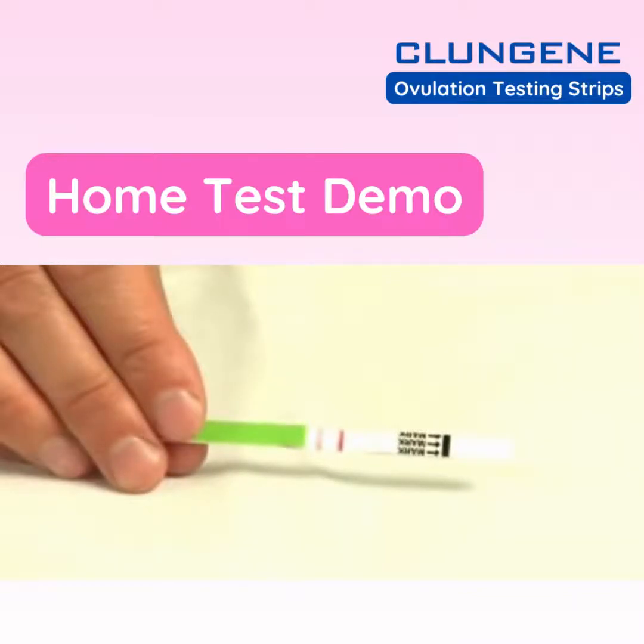At this point, you can lay the test on any flat surface. After 10 minutes, interpret the results.